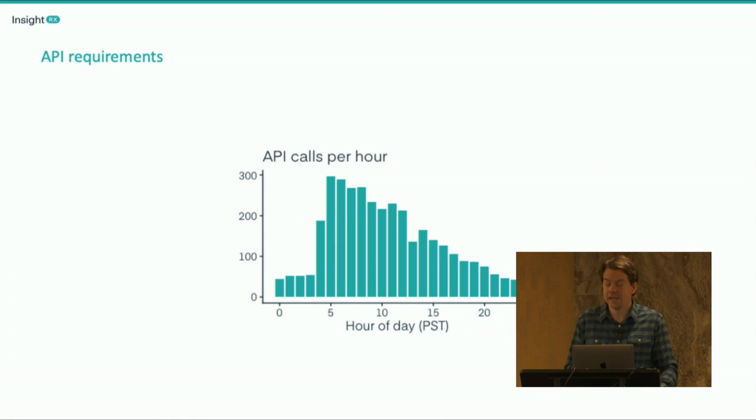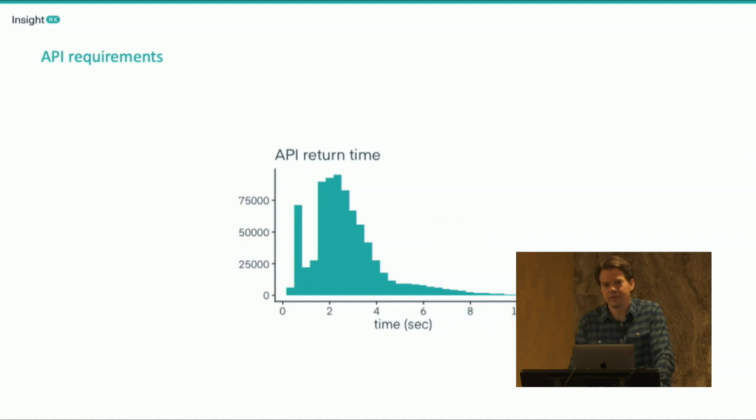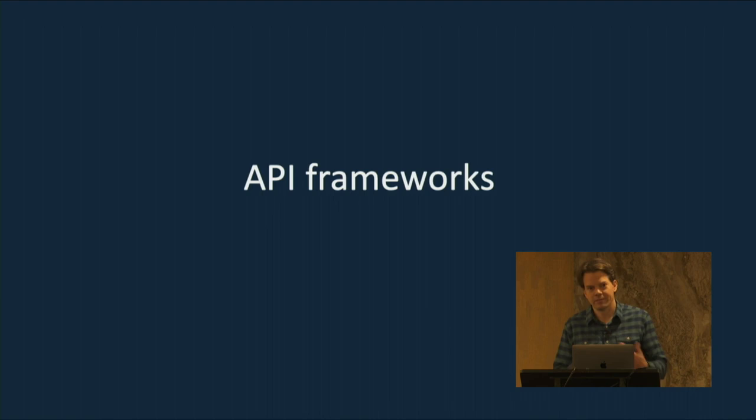And what you also have to keep in mind is that the length of the API call is not always the same. We have a lot of API calls that are really fast, within a second, but there are also API calls that take much longer, depending on how much information you have for the specific patient. So that also leads to the question of what API framework you're going to use.